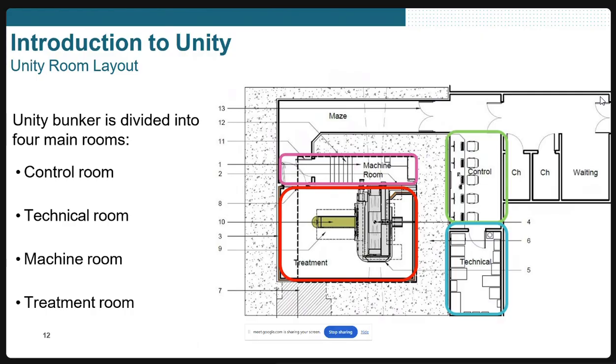So the semiconductor in the gradient amplifiers does not work well with the high energy X-ray scatter. So these things have to be moved out. In that process, they moved a lot of components from the inside room to outside, so that the inside room looks clean and neat, and at the same time you can do a really good job outside.